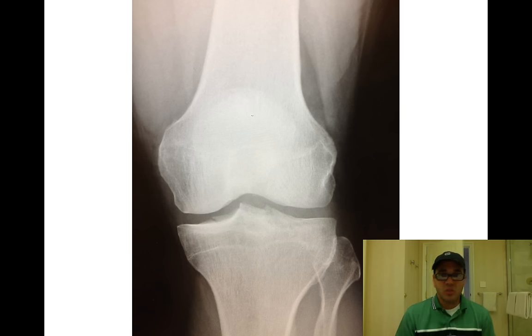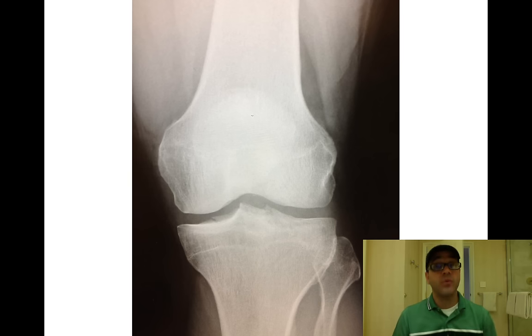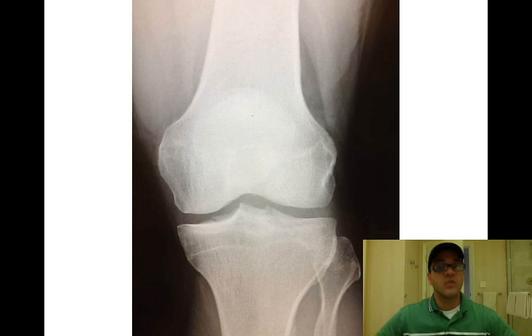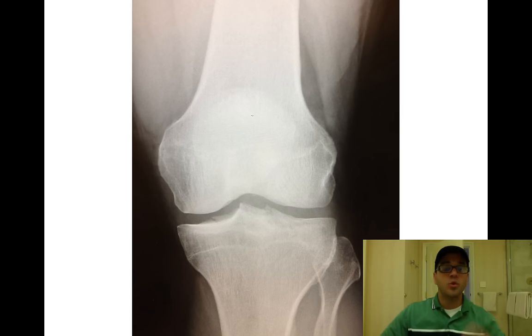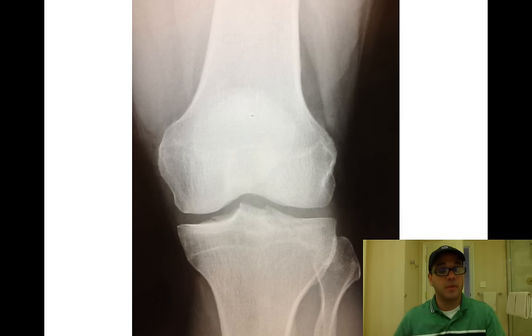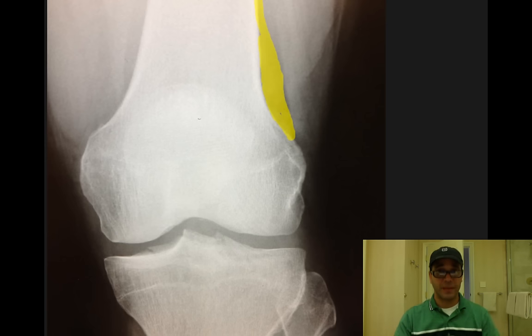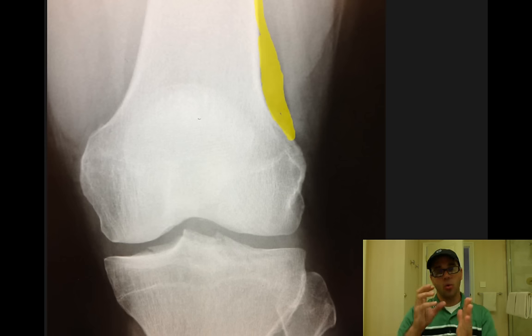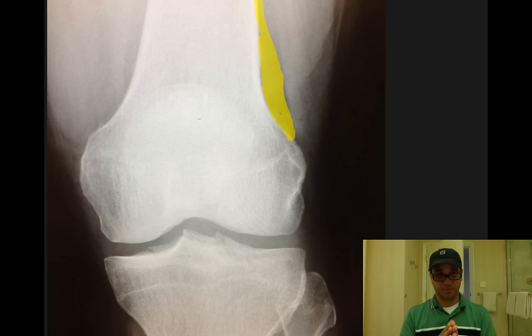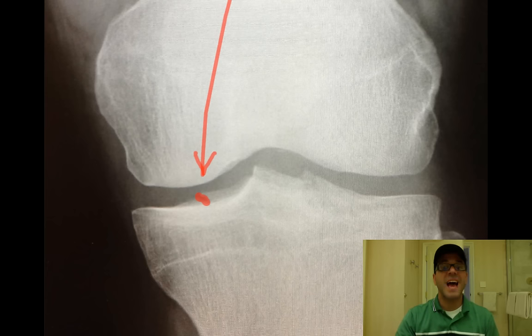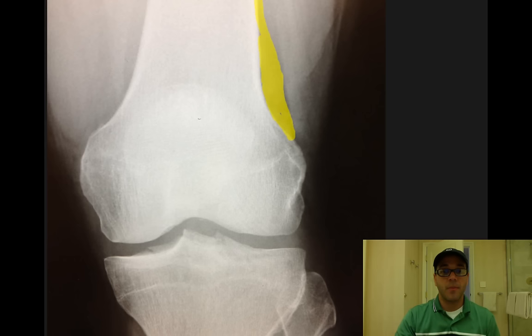This patient presented with knee pain and the X-ray doesn't look too bad at first. However, there's one important finding that should increase your suspicion for something wrong. Pause the video, take your time to look at it in detail, then move on. That finding is an effusion of the knee joint — you can see the separation or shadow showing there's fluid in the joint space, and that's a clue pointing toward where the fracture is.